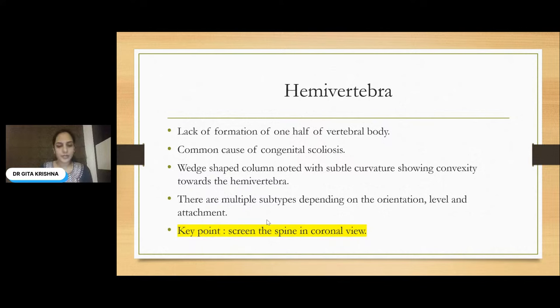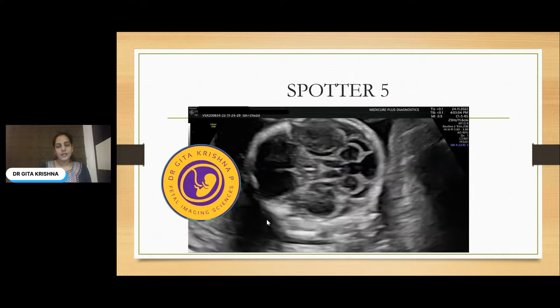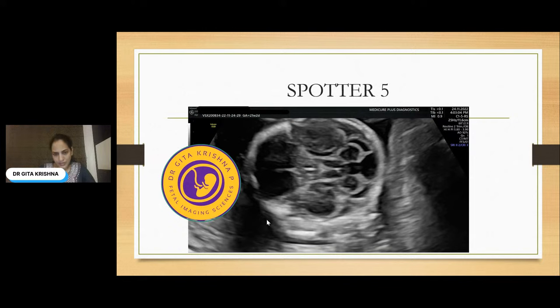Let us go to the next slide. This is spotter number 5. This is a fetus of 21 weeks old. We did screening at 16 weeks as well — it was absolutely normal at that time. Now we are able to see a continuity from the 4th ventricle to cisterna magna with a widened Blake's pouch. What is your diagnosis here?